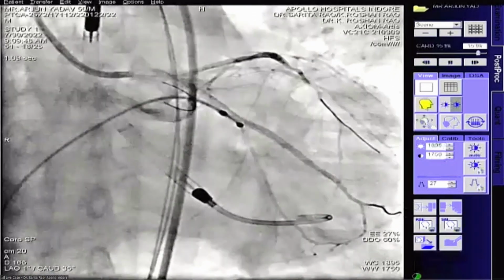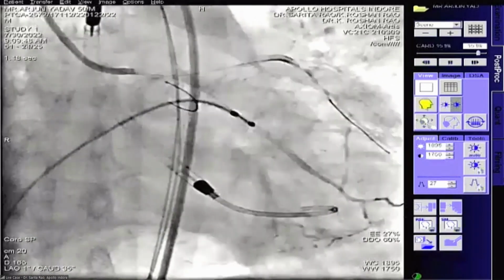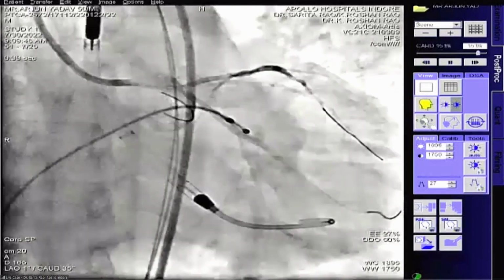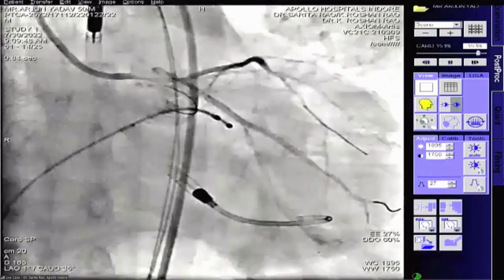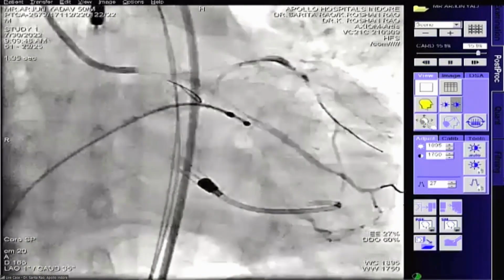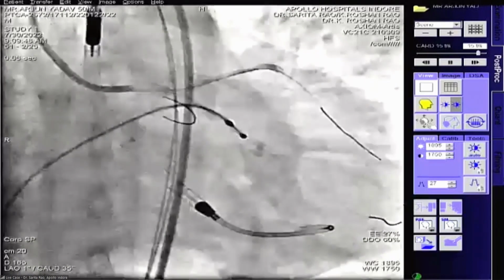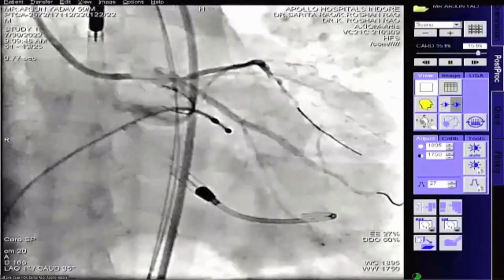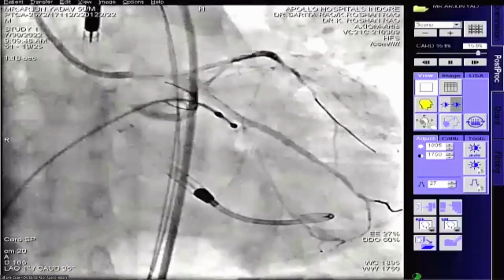Should we go ahead with the stent now? The length of the lesion which we estimated on the IVUS, it was... the diameter, the plan is to take a 3 into 26. What do you say? Yeah, that sounds good. Anyone else? 3 getting over inflated to 4. Would it be okay?